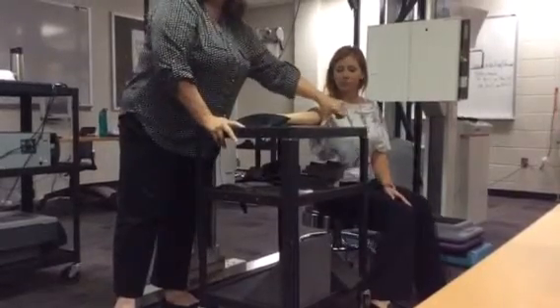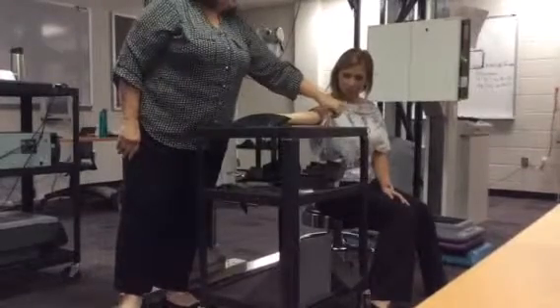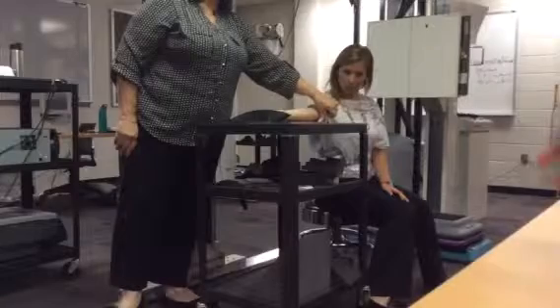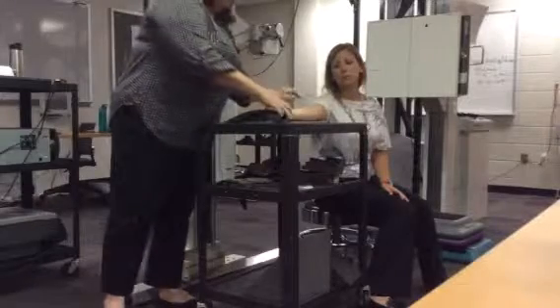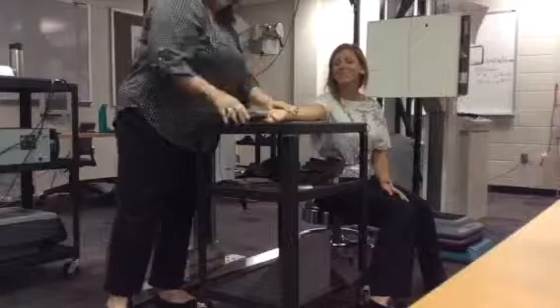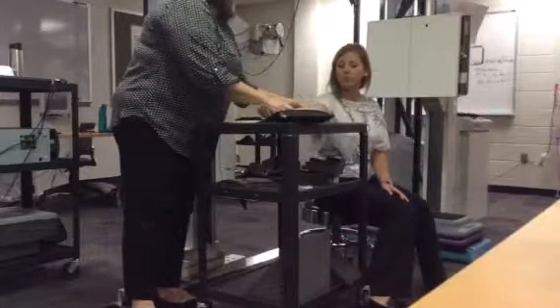Now the name blocker is at this end of the film. Be careful when you're positioning that film. Make sure that the structures you want to see are not under the name blocker. And it's easier if you put the name blocker on the opposite end of the joint you're trying to see. And that's why I'm doing the distal, because this was already set up with the marker up here at this end. But let's pretend there's no name blocker there.